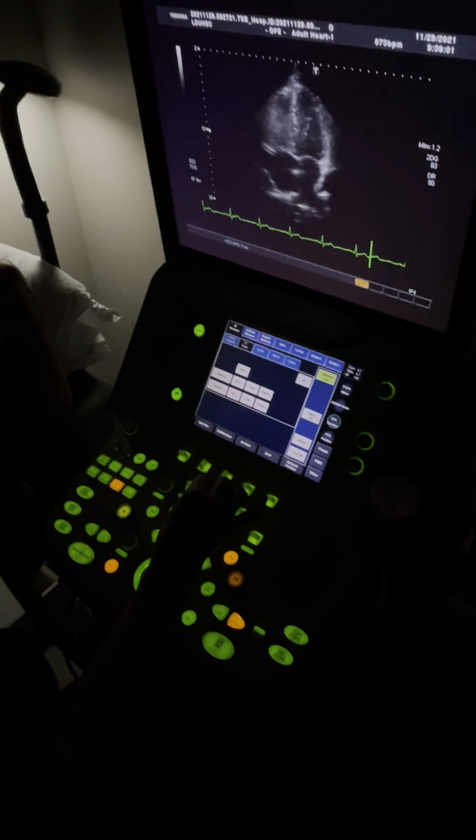Hold again. Oh, wait. Look. It's too dark. I couldn't see it. It's too dark. Can't see nothing.